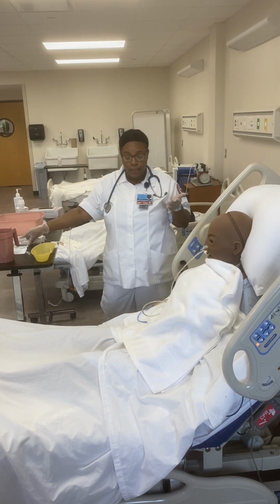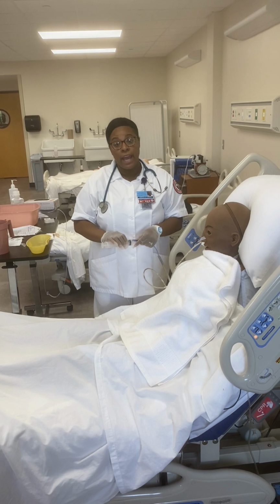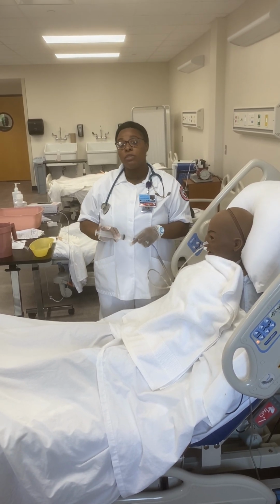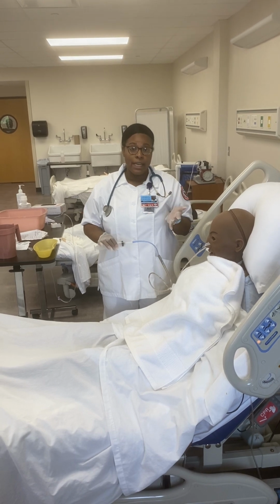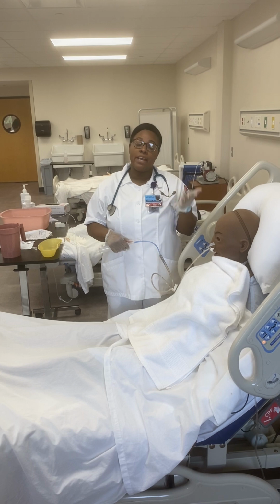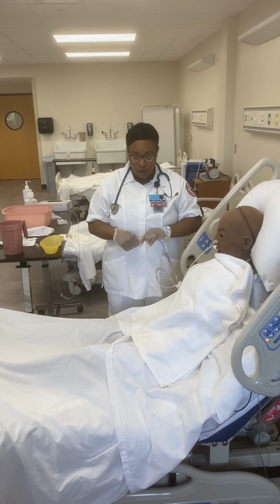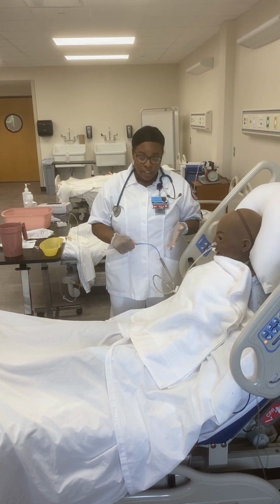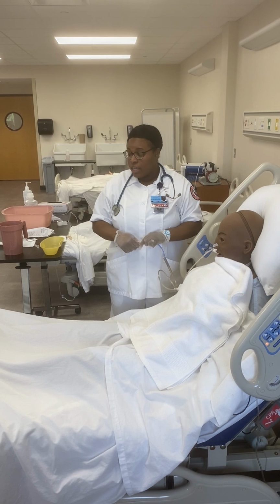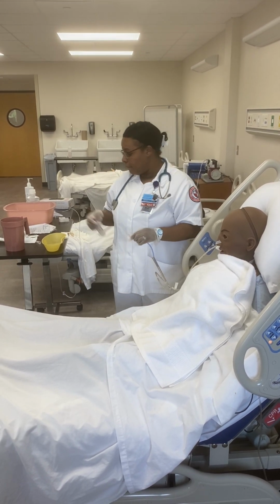And by check placement, we're going to aspirate gastric contents. If I remove 250 mils or less, I'm going to replace the gastric contents. If I get more than 250, if I get 500, or if I get 250 twice, I'm going to hold the feeding. My residual has been checked with the pH and it's less than 250, so I know I have verified my placement and now I can proceed with my feeding.